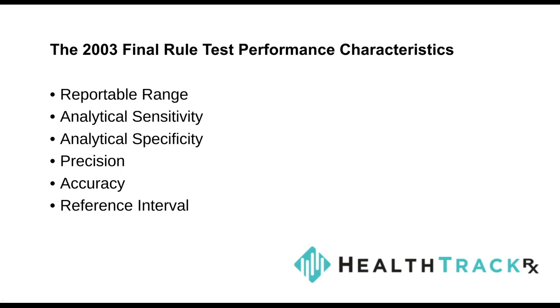Now, I'm not going to get into the technical details, as these guidelines are widely and very clearly available, and that would entail a whole different presentation. But the important point that one has to keep in mind is that according to CLIA, one has to establish, albeit not in the same great detail, these test performance characteristics even for FDA-approved tests in your laboratory.